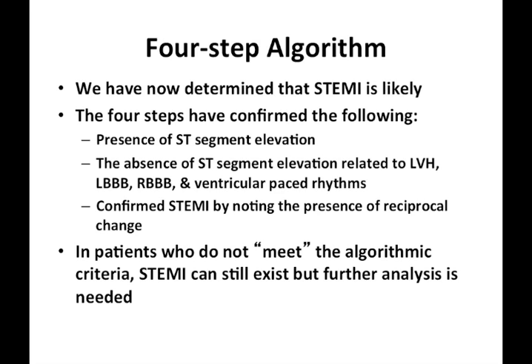Now, there will be patients who do not meet the algorithmic criteria and still have STEMI diagnosed, but this will hopefully be detected later in the pre-hospital phase or after arrival in the emergency department. This algorithm is not designed to detect all STEMIs, but it is designed to detect most STEMIs.